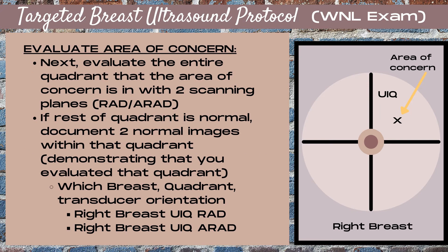After taking two specific negative images directly over the area of concern, you next want to evaluate the entire quadrant that the area of concern is in. For this example, that means evaluating the entire upper inner quadrant of the breast in both radial and antiradial planes. Once you've determined the quadrant is completely normal and no pathology was found, you want to document to your radiologist that you've evaluated not only the area of concern but also the surrounding tissue. So take two negative images of that quadrant as well.